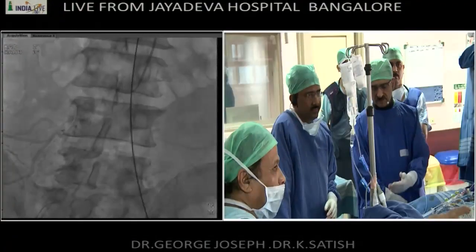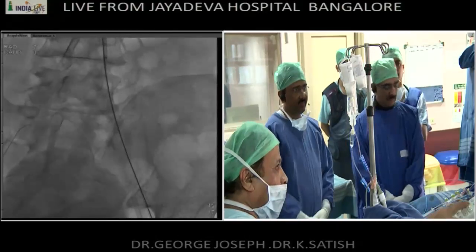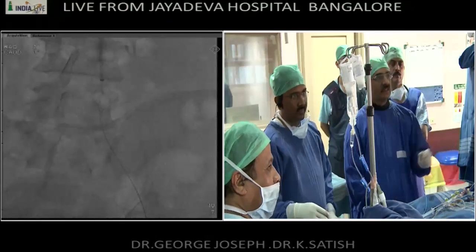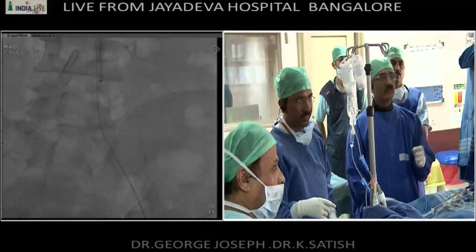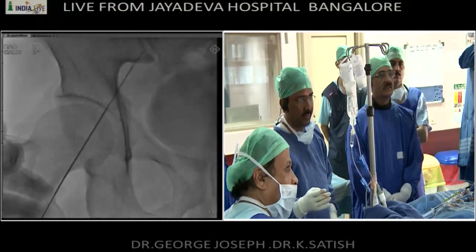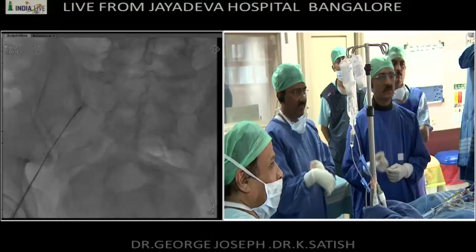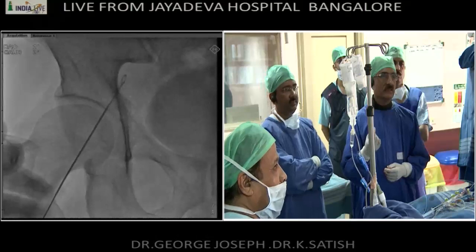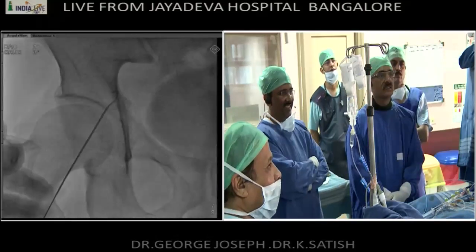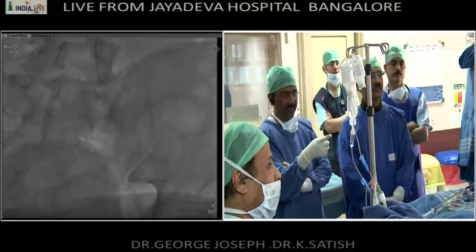Okay, so my strategy for today is I will enter the CTO retrogradely because I am seeing a small track into it from below. But there is a very high chance that when I reach the proximal end of the occlusion, I will start going subintimally in the aorta.